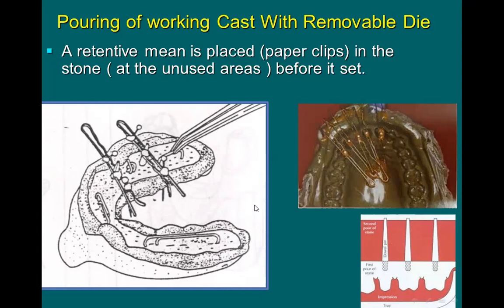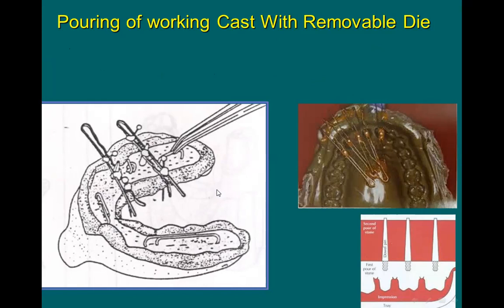When we do this and when the first gypsum material is set hard, in the right pictures you can see the positioning of the different dowel pins.